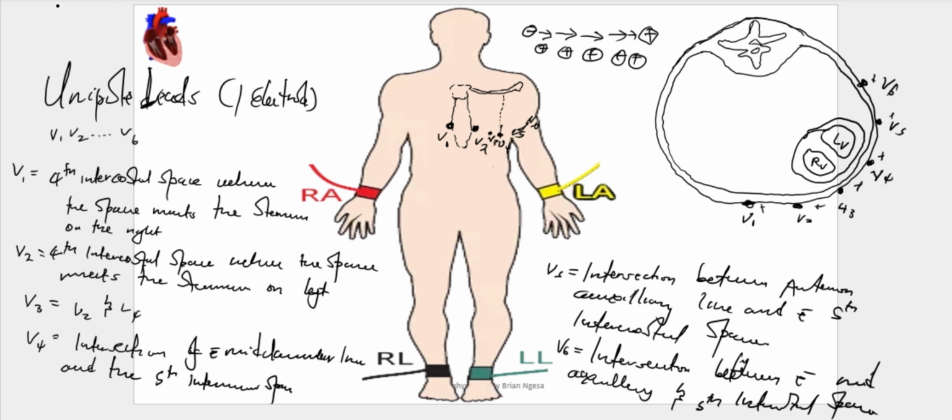So if they are moving somehow in the same direction, the positive towards the positive, giving us an upward deflection. If it's positive, again with the same story, same as what will apply to the negative charges as we said.